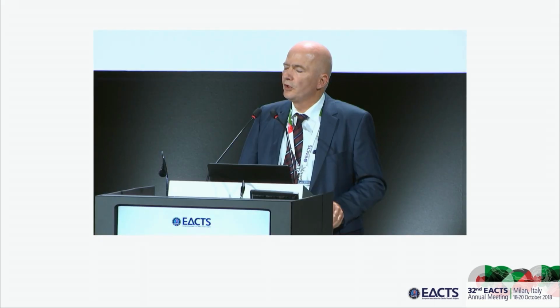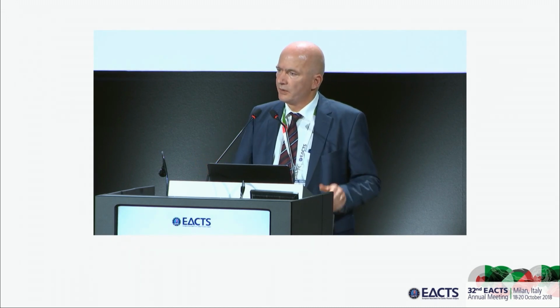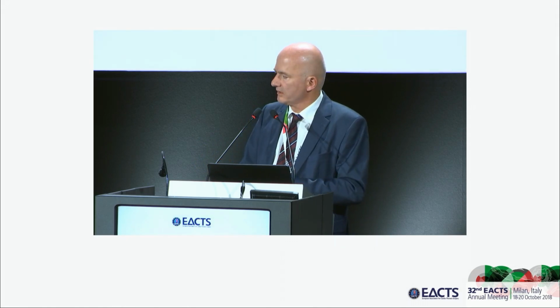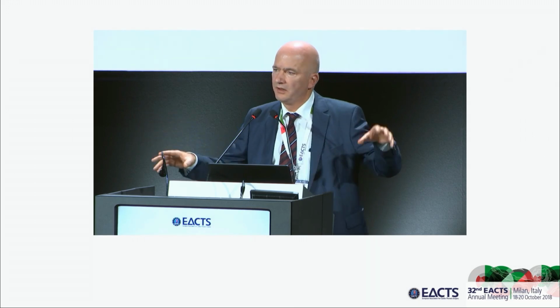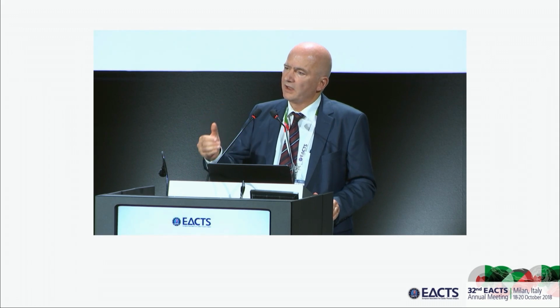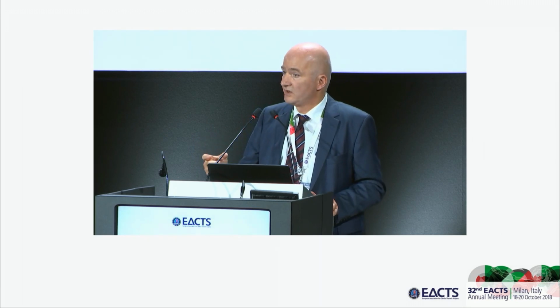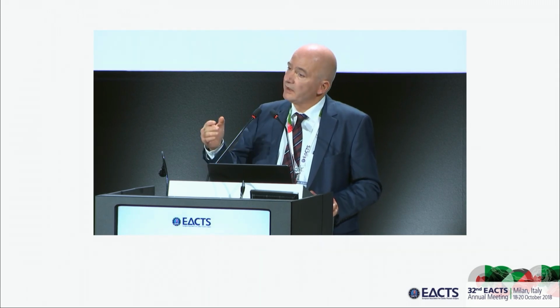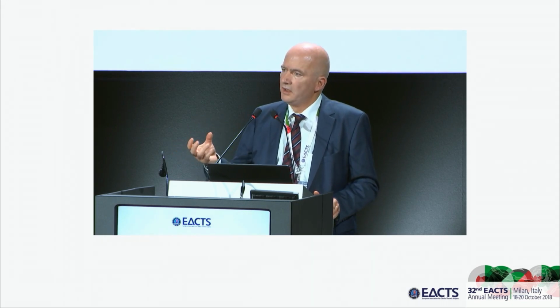If we do 3D, there are a couple of systematic errors. One is there is a difference between annular size on the cardioplegic heart and on the beating heart. And this is a systematic error simply between any imaging and intraoperative determination. Second, the left ventricular outflow tract in diastole usually has an oval shape. So the key question is which diameter do we take, the shorter or the longer? But then it also changes during the cardiac cycle. It becomes circular during systole.